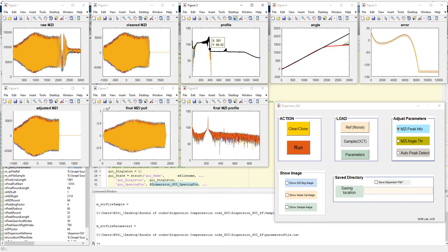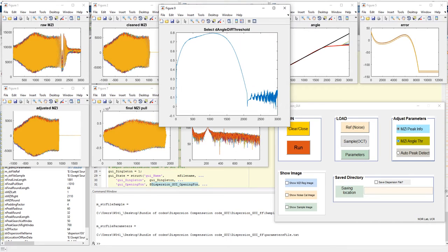So that's stage 1. Now you have to select the phase range to see what data is good. If you set the phase threshold value equal to 0.3, then you are cutting all the unusable data and using the usable data for your calculation of phase noise.